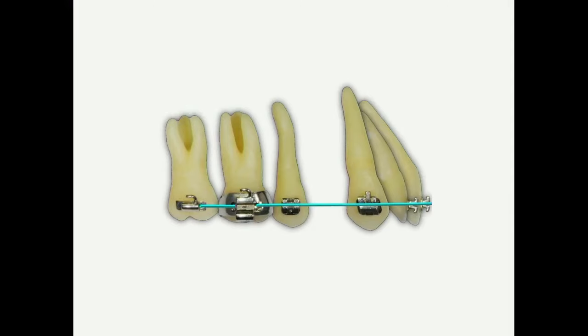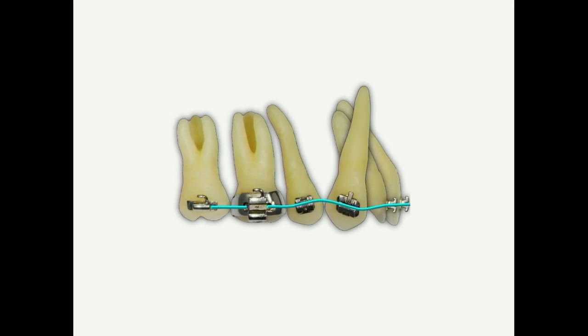Let's take a look how side effects are produced by continuous full arch wire. For example, in a typical extraction case, full arch wire was inserted prior to retraction for leveling. And space was closed. Let's suppose the arch wire was not rigid enough so that the teeth tipped into the extraction site.